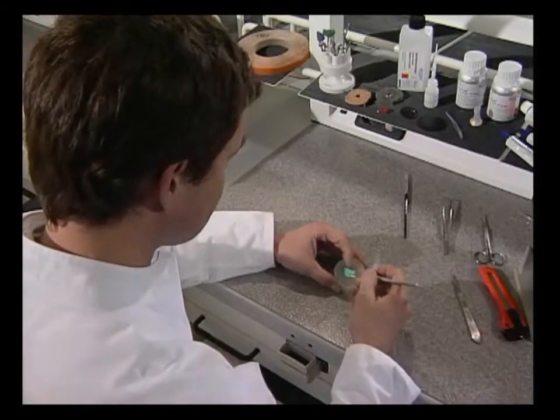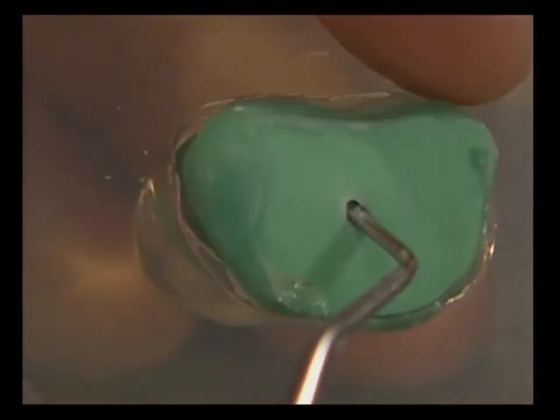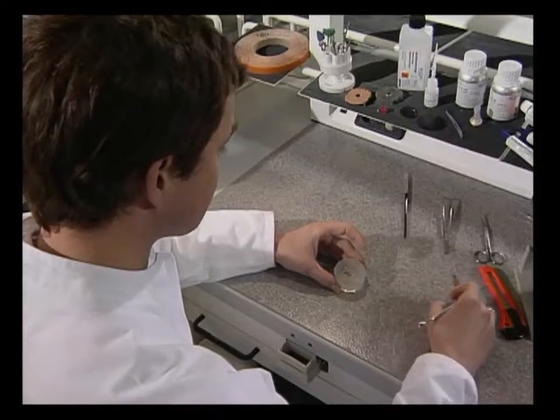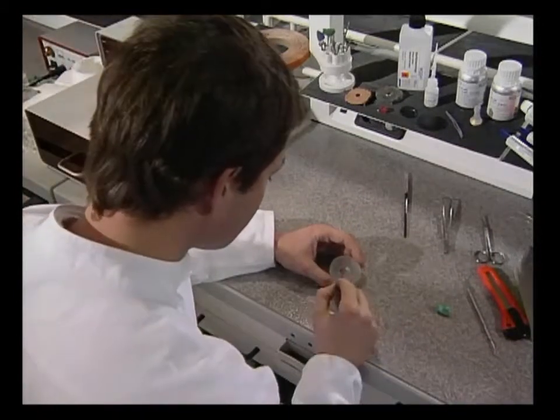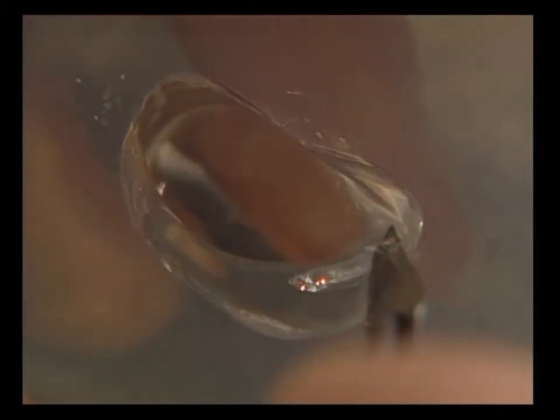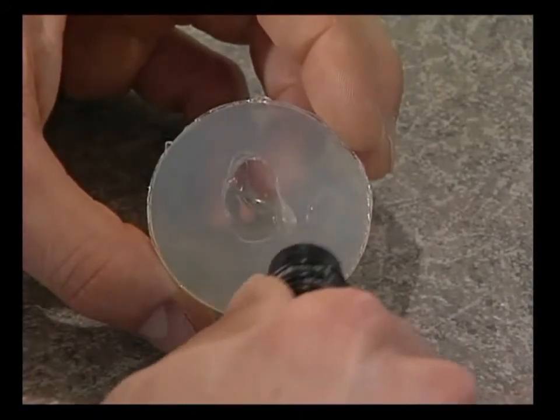The impression removing instrument is then used to take the impression out of the duplicating material without damaging the negative form. Overhanging duplicating materials are cut off at a right angle by a scalpel without damaging the negative form. The form is carefully blown out with a slight pressure.